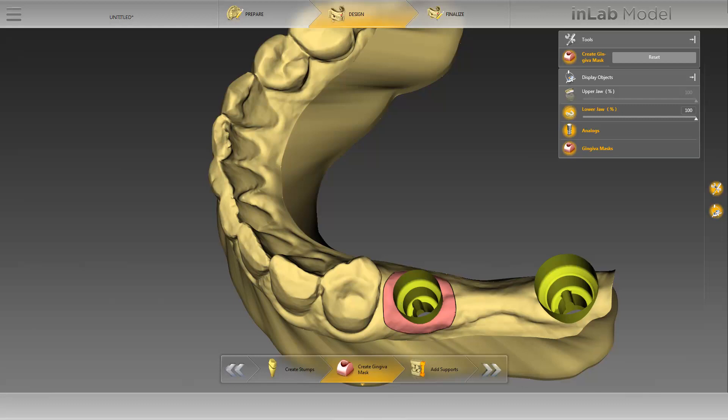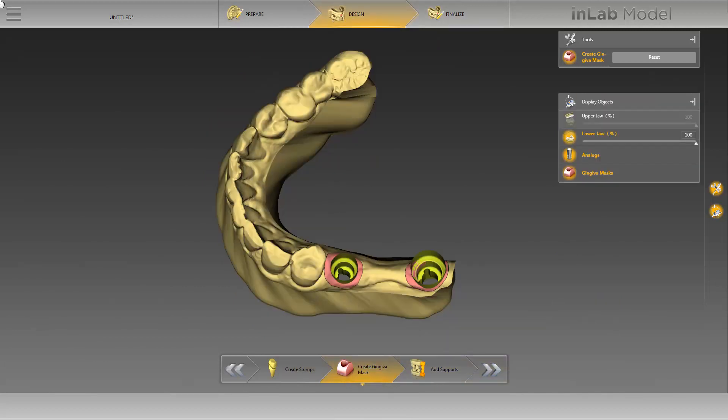Creating the gingival mask for our second implant uses the same procedure, so we will skip the demonstration so that you now already see the two finished gingival masks here. To delete an individual gingival mask, click on the gingival mask in question and delete it using the Reset button. At this point, we will switch to the last step in the design phase, the Add Supports step.